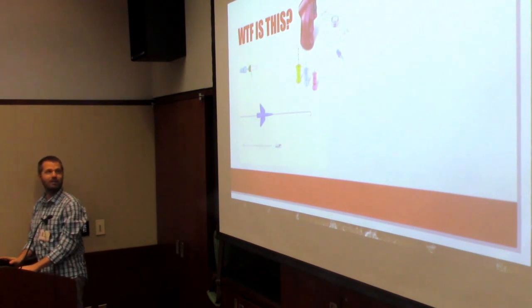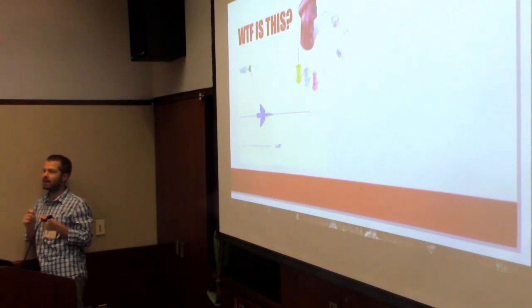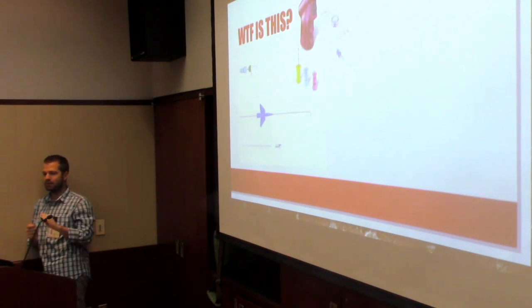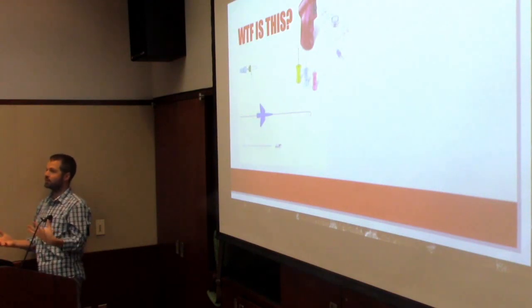The IO gun. Especially in peds, there are different guns and different hand tools, and a lot of them I'd never seen. There was a patient who died in the PICU, and apparently they tried like 3 or 4 times to put in an IO, and they were using the guns, and the baby's bones were so soft they just kept drilling through and through. There were like 6 of the manual drills, but no one had ever used them before, so no one knew what they looked like.